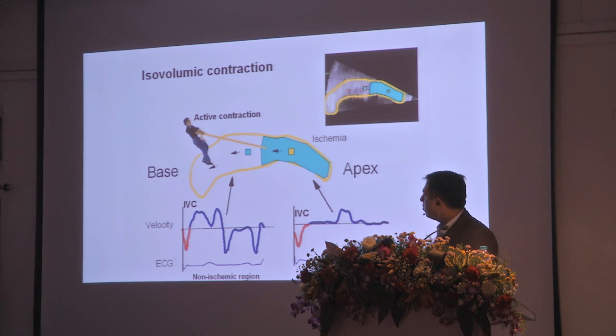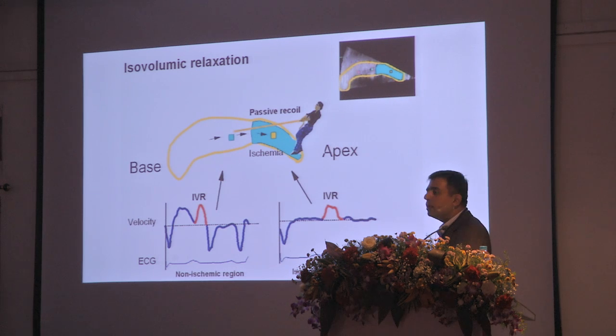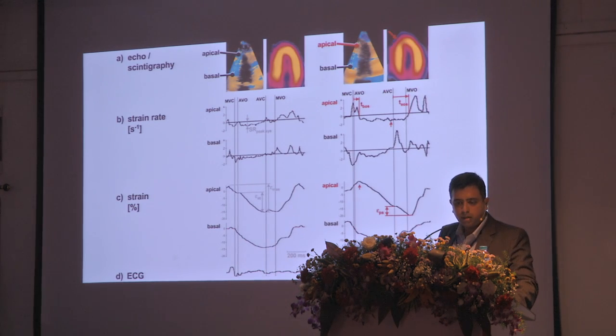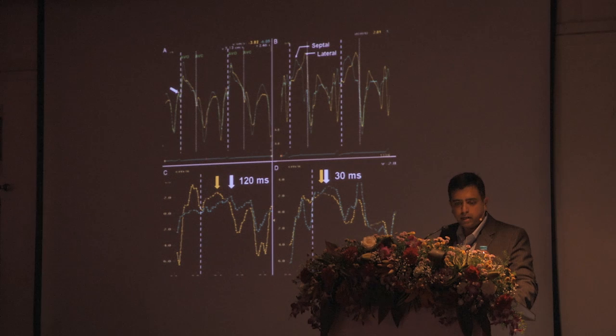ATP problem. Okay. So while they are relaxing, they aren't relaxing fast enough compared to the other segments, and this causes a pull on the surrounding segments as well. And this has been very well validated.